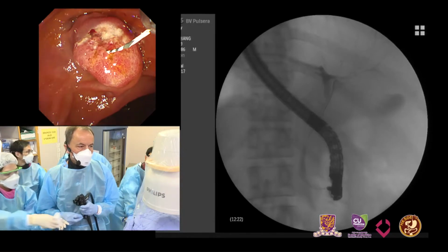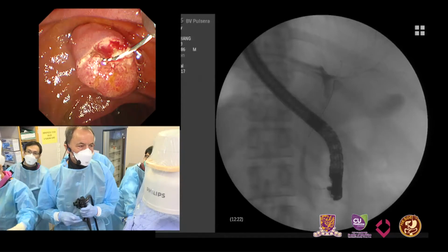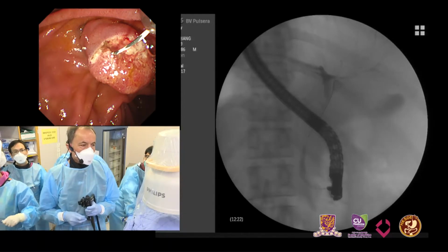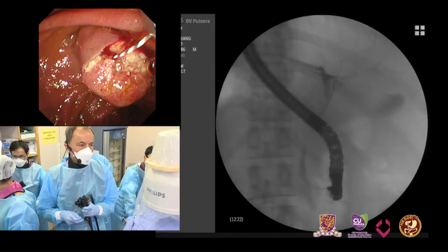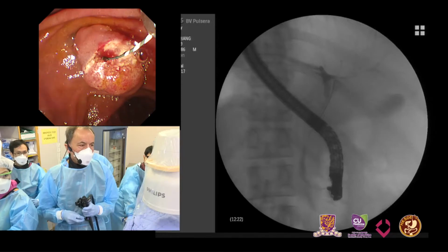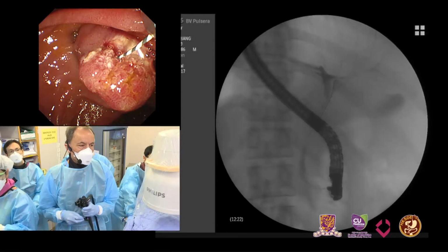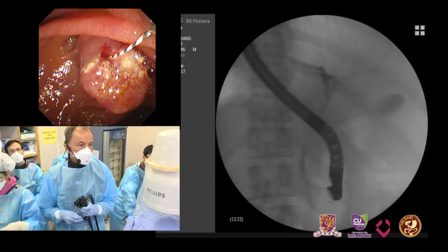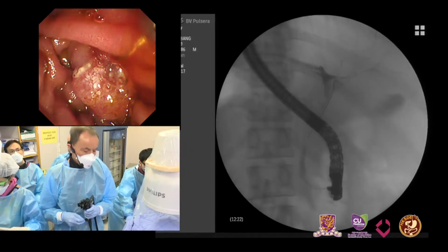So this is here the border between the oblique markers and the cross markers. And that means the tip of the wire is now exactly 9 centimeters inside the duct. And now it's 7 centimeters. So this is 7 centimeters inside where the oblique markers begin, and this is here at 9 centimeters.